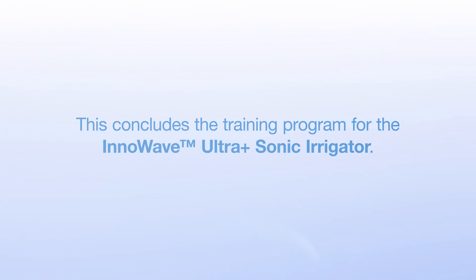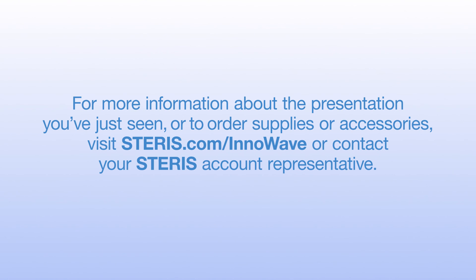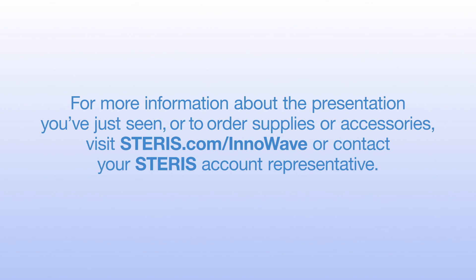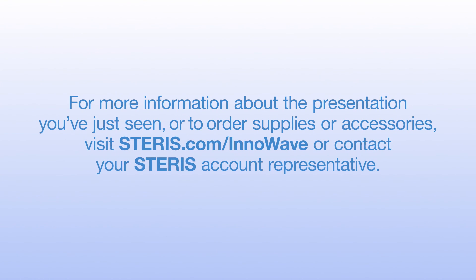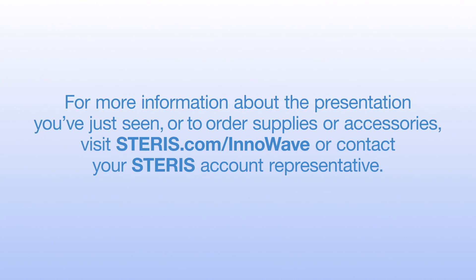This concludes the training program for the InnoWave Ultra Plus sonic irrigator. For more information about the video you've just seen, or to order supplies or accessories, visit Steris.com/InnoWave or contact your Steris account representative.